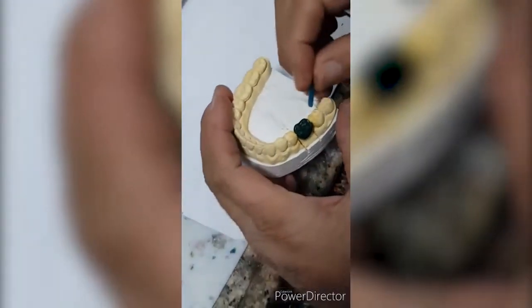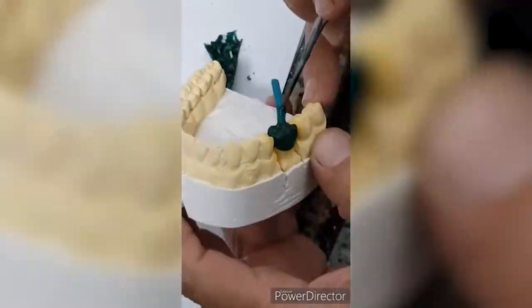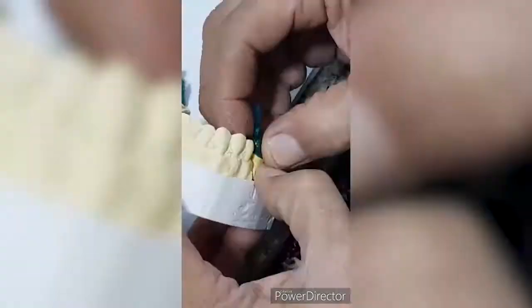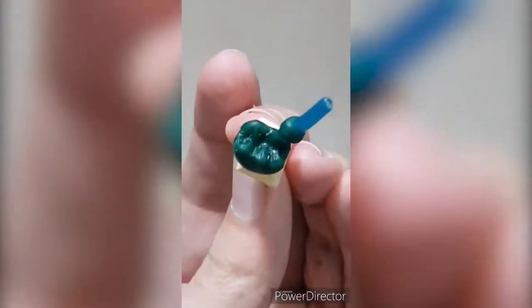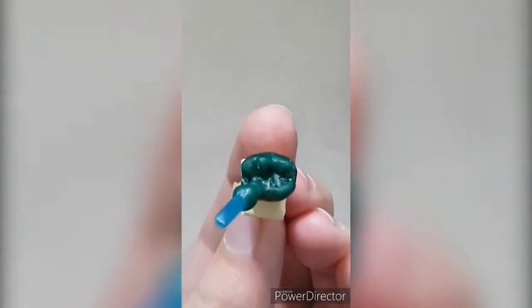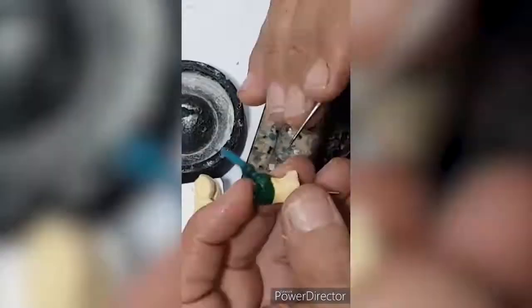The main purpose of the sprue is allowing metal passage. Place the sprue and cover it with wax in order to sustain it in place. Then place the sprue attached to the wax onto a rubbery crucible former.